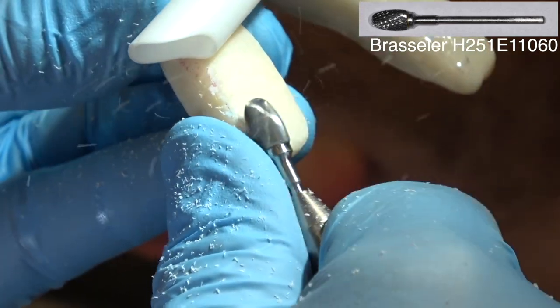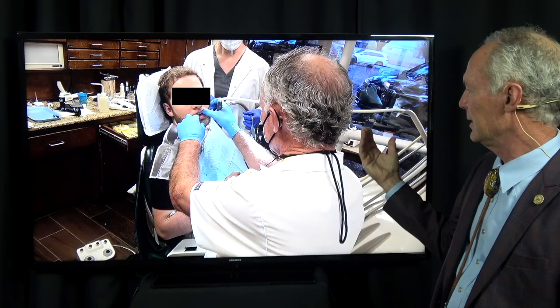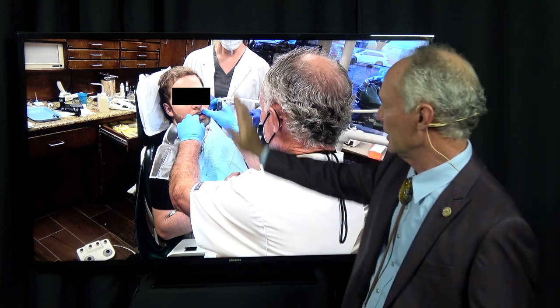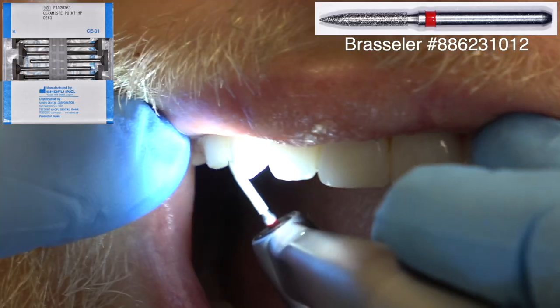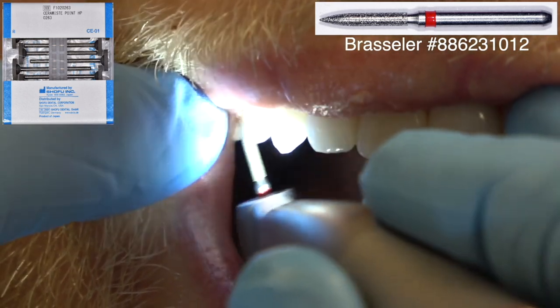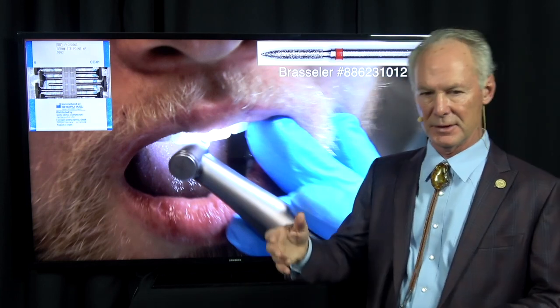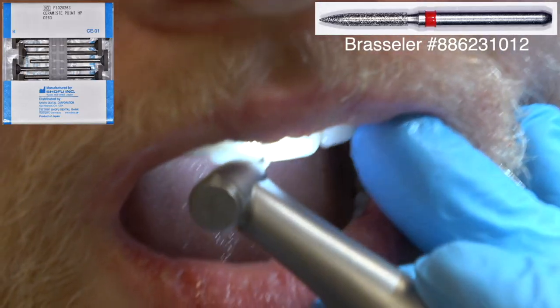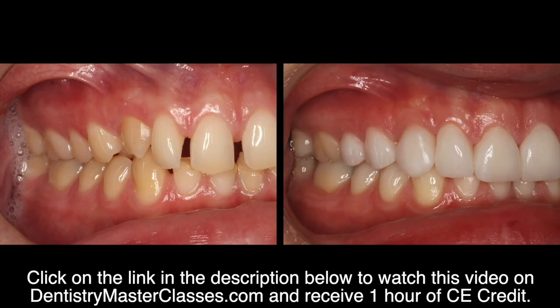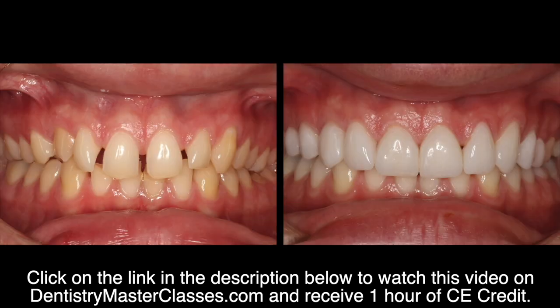So I'm checking the incisal edges of the anterior teeth with me sitting up in front of the patient. So I've got a direct view at his face with his pupillary line parallel to the floor. And just see what the incisal plane looks like. Don't check all that with him laid back and you at the side. You can't get it right. Sit him up so he's looking straight at you, and that's, you can adjust the incisal plane. Then you can come back and fine tune it with him laying back.